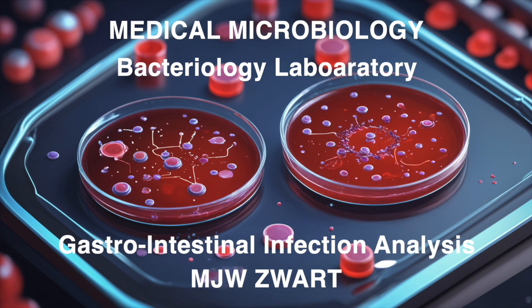So now that we've got them growing, what do we do? Well, next we'd do sensitivity testing. Figure out which antibiotic will work best for this particular Campylobacter infection. That makes sense. So case solved. Traveler's diarrhea successfully diagnosed and treated. This algorithm is pretty slick. It definitely helps. But are you ready for a slightly tougher case?